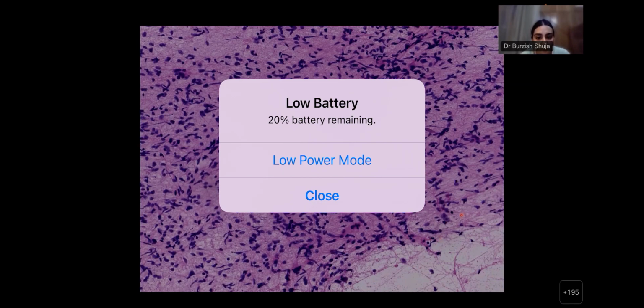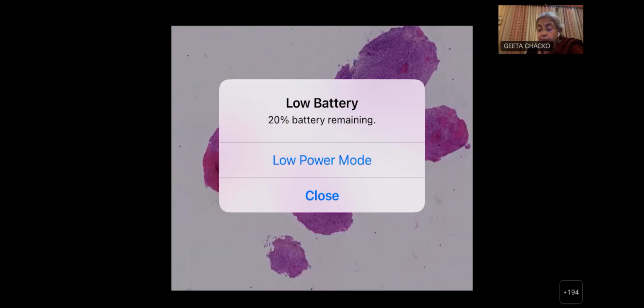Okay. I'll later on show you what thickened vessels look like. Although you're right that sometimes these tumors do have vascular proliferation seen as thickened vessels, here we're really just seeing parallel rows of endothelial cells. So I wouldn't quite say these are thickened in the smear, but it's very cellular, like you rightly said, and it's quite pleomorphic in appearance, right? So these are the fragments that we got of the tumor.